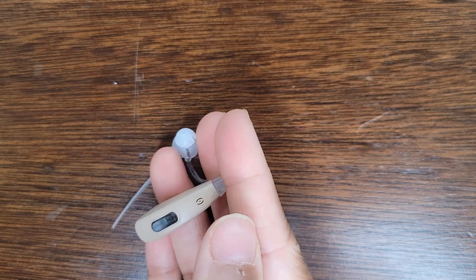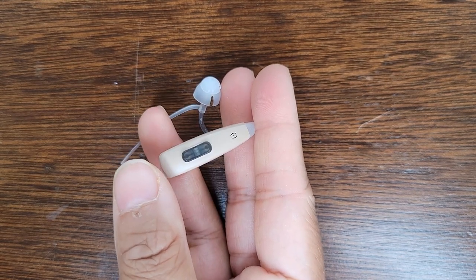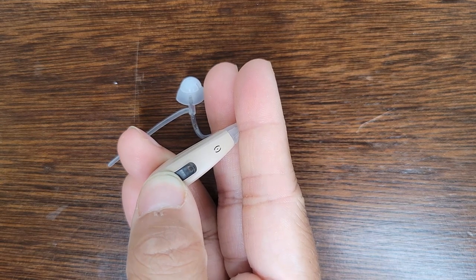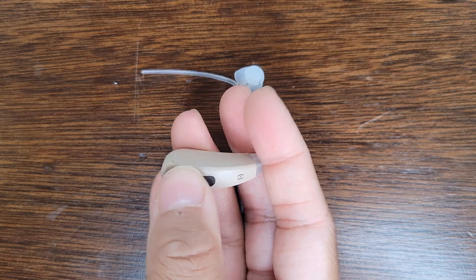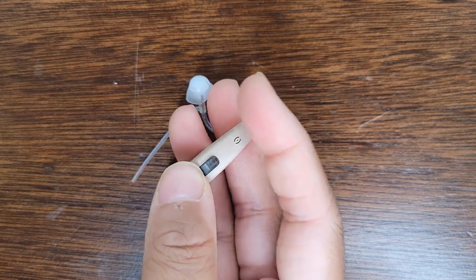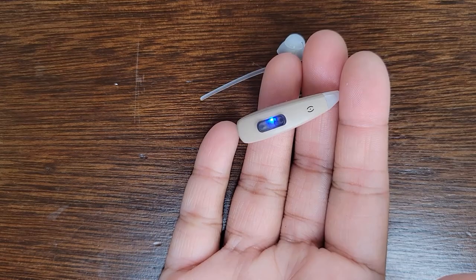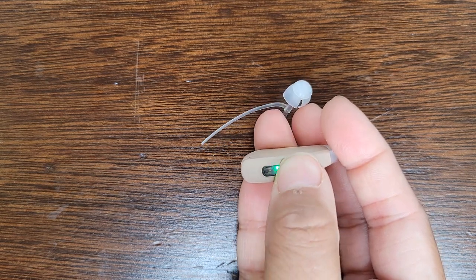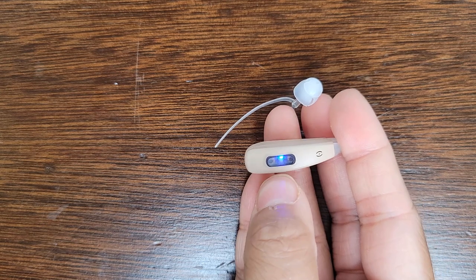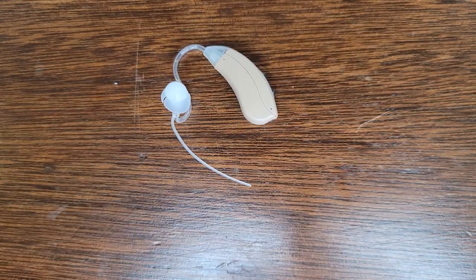So let's try and see that green light that flashed. That indicates that our hearing aid just turned on. And then let's turn it off. So, all right, it's on right now. So you just long press this and turn it off, right? So now it's in the off mode, and you'll see that when it's in the off mode, it'll glow blue, and when it's on, it'll glow green.